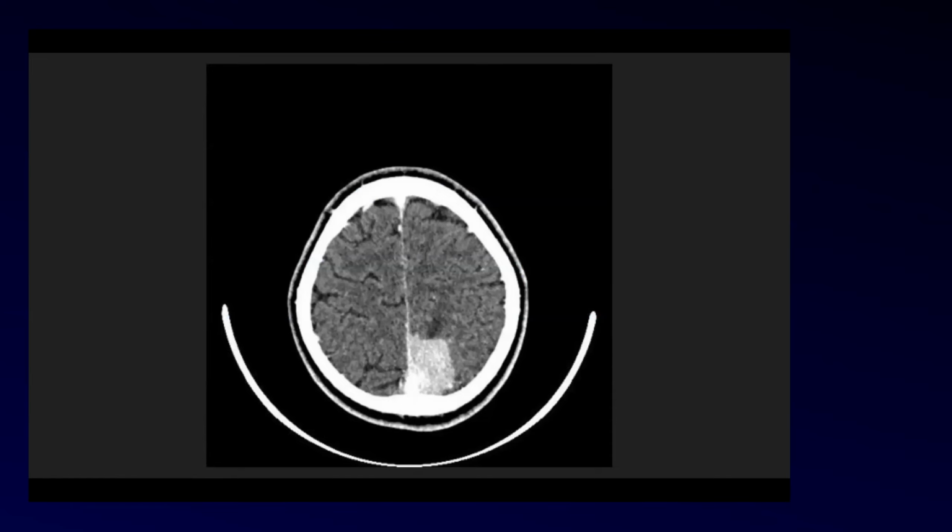This is the CT, and you can see the hyperdense lesion well described, abutting the midline. There is some involvement of sinus as well, but we can't be sure how much of it.